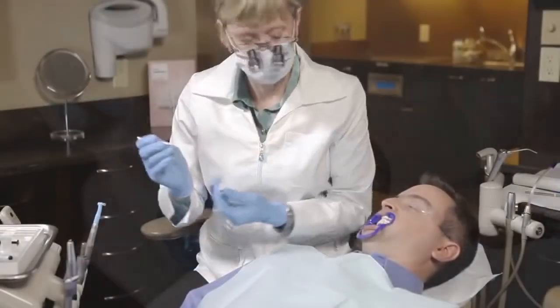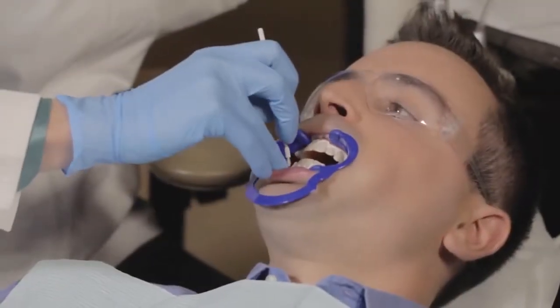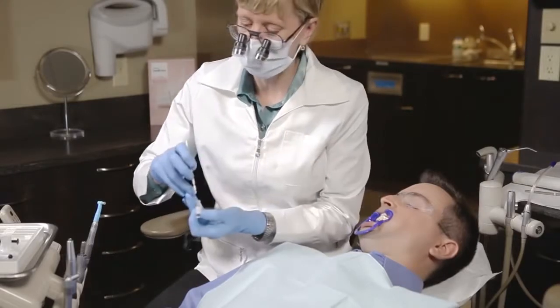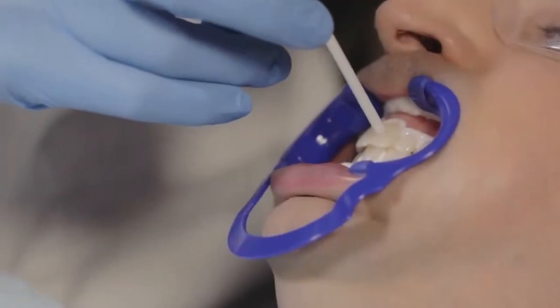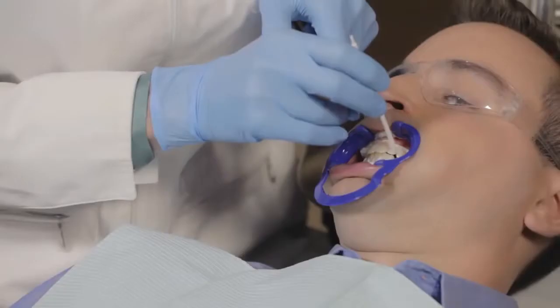If applying a fluoride varnish as well, the Quick Pro whitening varnish should not be applied past the first or second premolars. The fluoride varnish will be applied to all remaining non-treated tooth surfaces after the Quick Pro application. Once the whitening varnish is applied, let air dry until the teeth do not feel sticky — the varnish should feel dry to the touch.